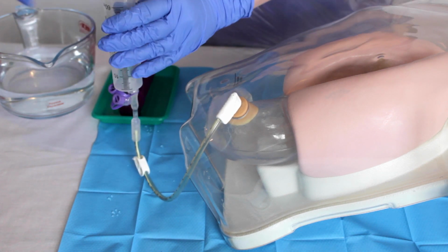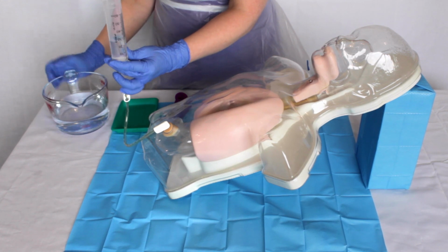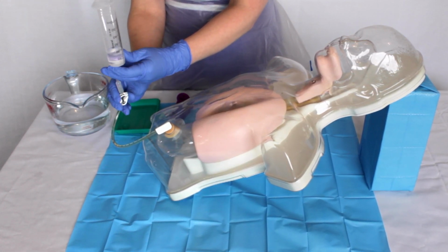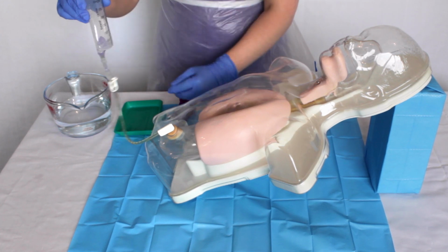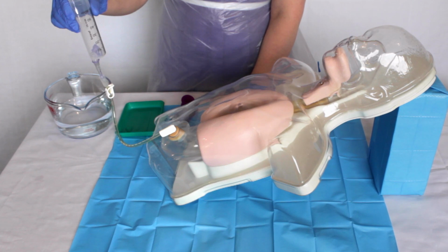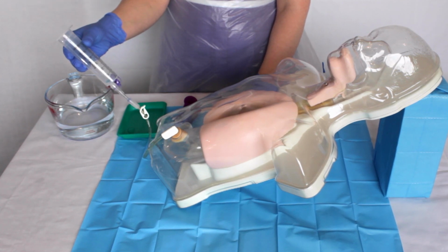Pour the required volume of water into the syringe barrel and open the feeding tube clamp or release your fingers. Allow the water to flush through the feeding tube via gravity and close the clamp or kink the tube between your fingers before air enters the tube. Repeat these steps until the total advised volume has been administered.